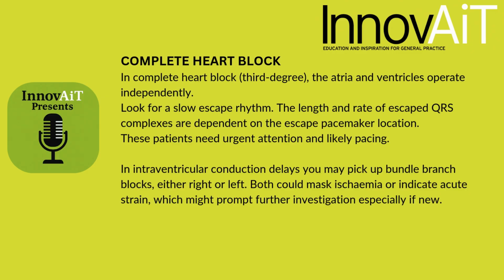In intraventricular conduction delay, sometimes you will pick up a bundle branch block, either right or left. Both could mask ischemia or indicate acute strain, which might prompt further investigation, especially if new.